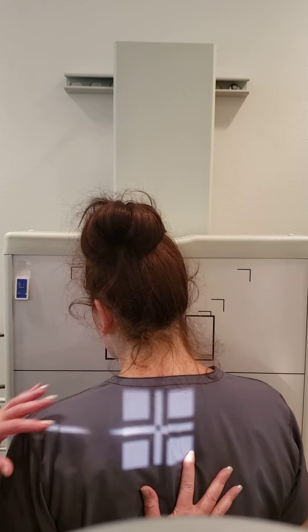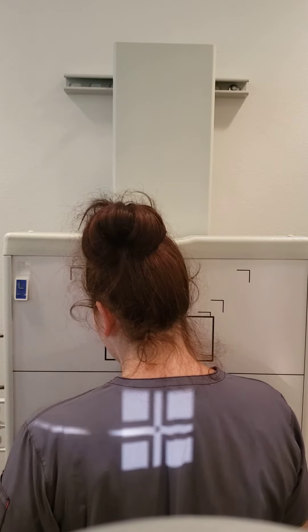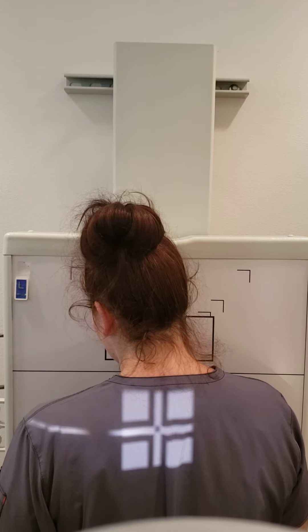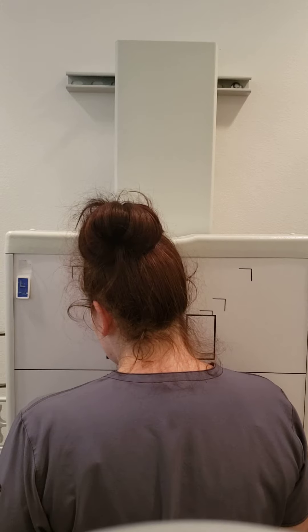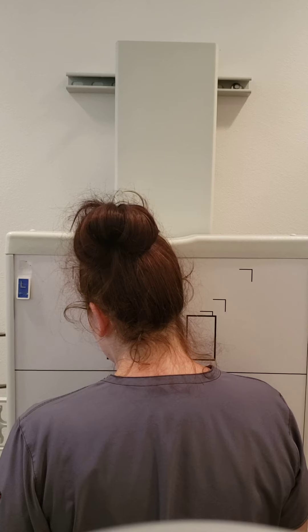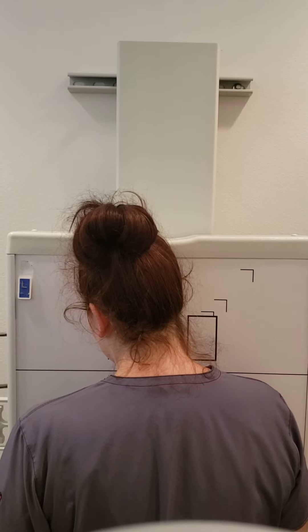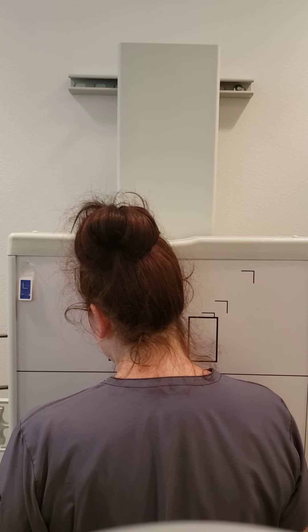I'm going to center you over here, that's three to four inches. Take a nice deep breath in — actually, I want to do that on expiration. Go ahead and relax. And that's a two view or three view sternoclavicular joint series.